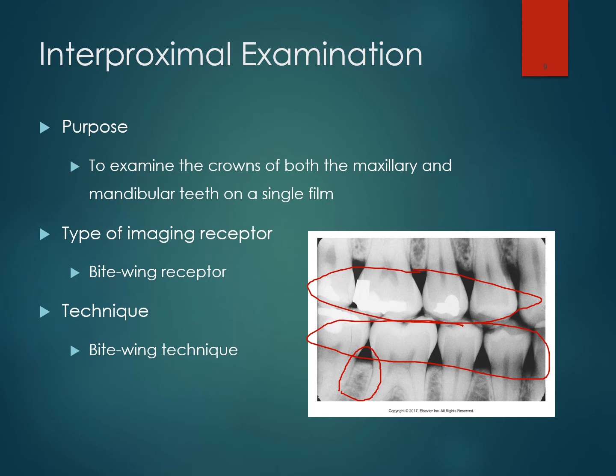We have to use bite wings when we are measuring for periodontal disease because of the angle that we use to take these radiographs. And I'm going to say this to you a million times later, so don't really worry about it too much. The other thing that we need to get on a bite wing radiograph is called an open contact. Now, if any of you were assistants beforehand, you already know opening contacts on bite wings can sometimes be a challenge. Some people have a little bit harder of a time getting the concept of it, but we are definitely going to send this home.